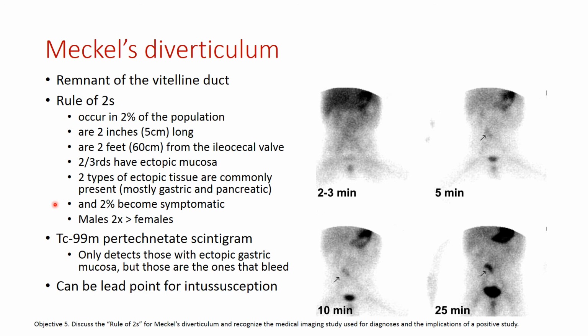What we use for nuclear medicine imaging is something called technetium-99m pertechnetate. Now, technetium-99m is the radionuclide that we most commonly attach to a pharmaceutical agent to incorporate within the body system, within the physiologic system that we're looking to study. In this case, this is just straight technetium-99m as it comes out of the generator. We have a molybdenum technetium generator, and we get our technetium right out of that generator, and this is the technetium just straight up.